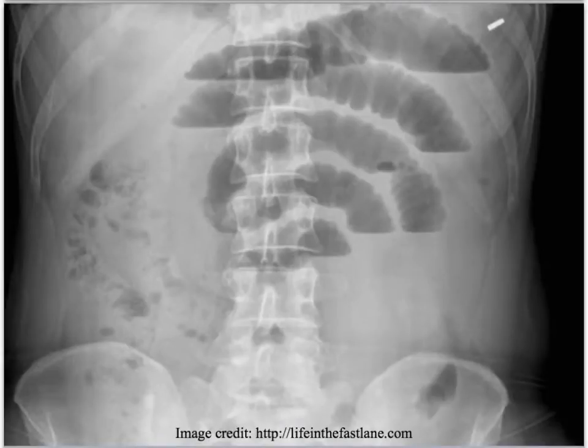In addition to free air, x-ray may also give us other clues as to the cause of the perforated viscous. In this case, we are able also to see dilated bowel loops from a bowel obstruction.